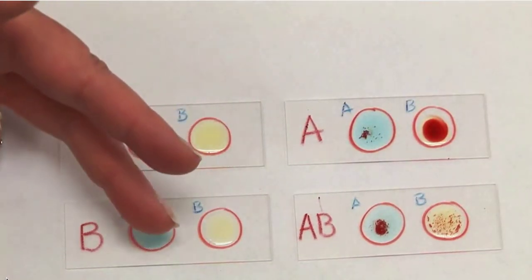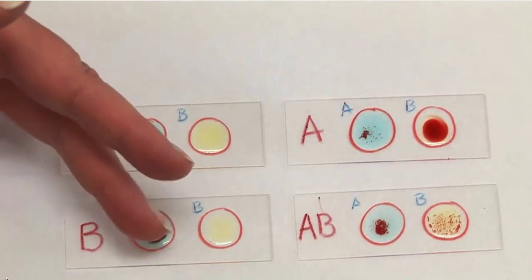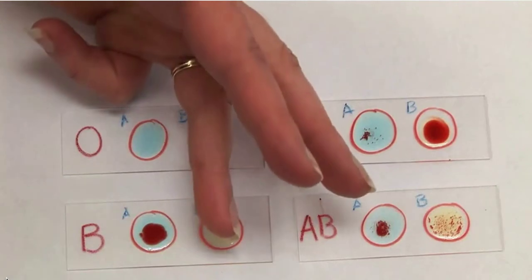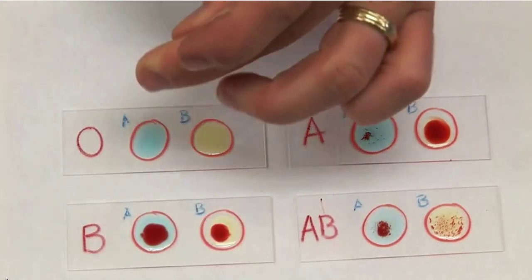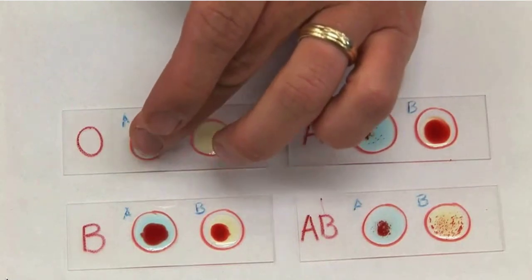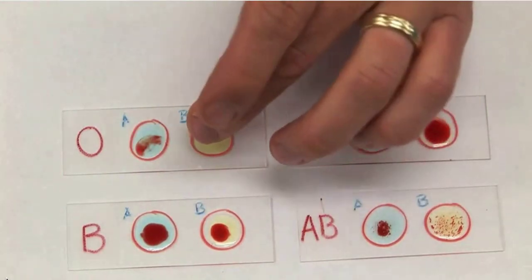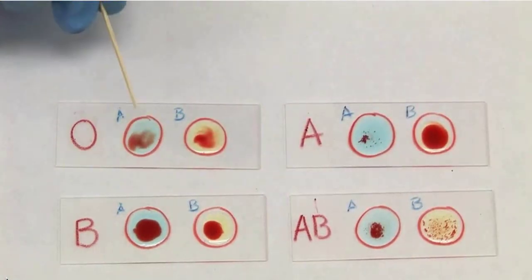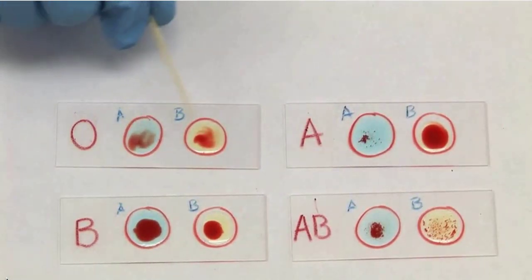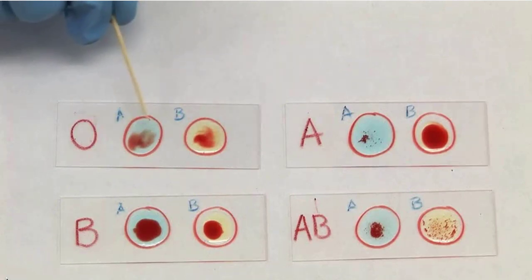Drop of blood, antiserum for A or B. Into the antiserum for A. And a drop of blood into the antiserum for B. In type O, we have homogeneous solution or mixtures of A and B antiserum.